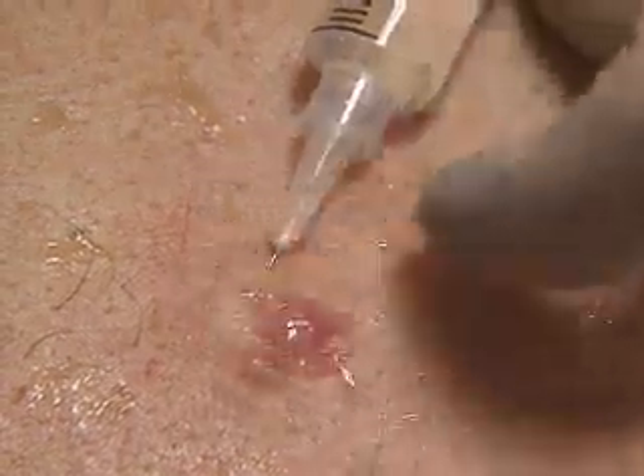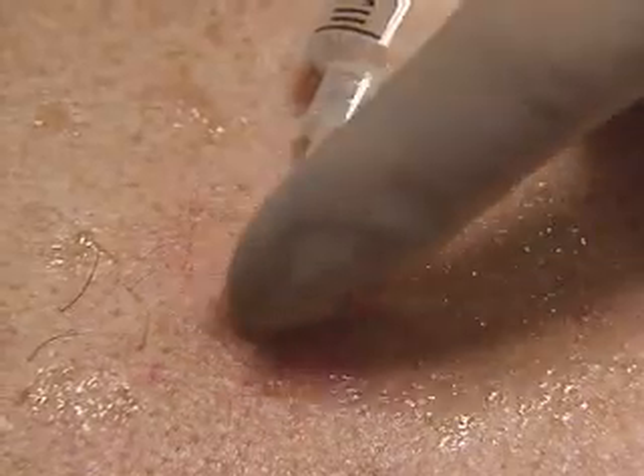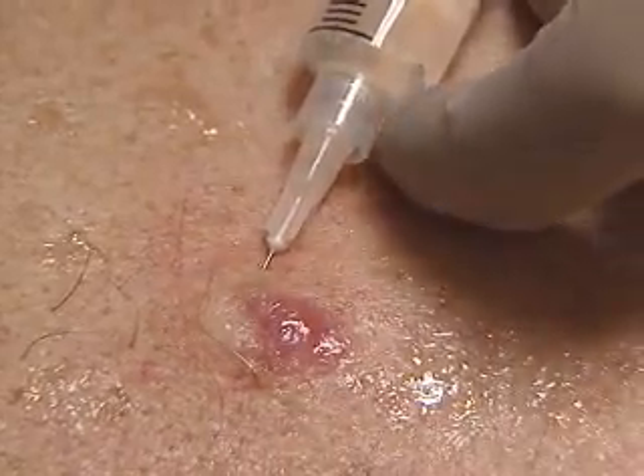You may see a slight blanching of the skin. That's telling us the infiltrate is close to the surface, as it should be.